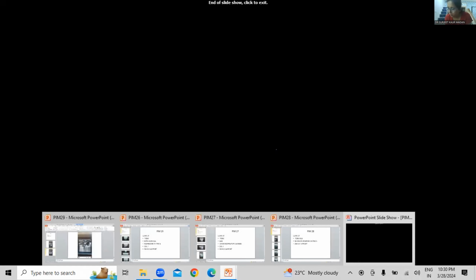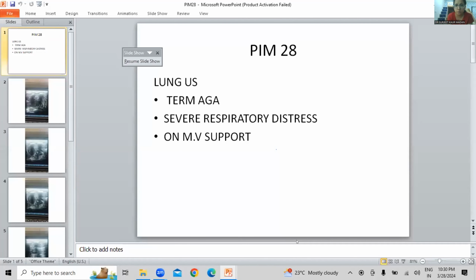So another one, this very small nice presentation. Which machine, ma'am? This is Sonosite.